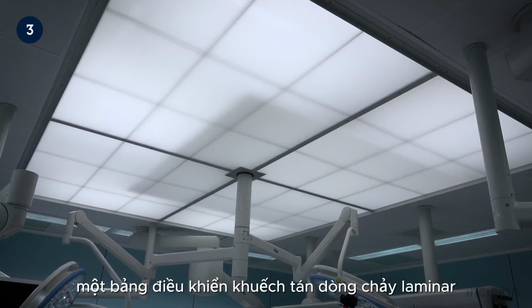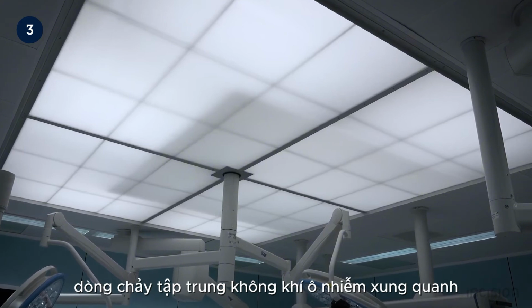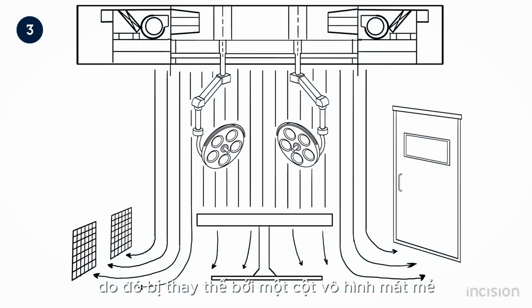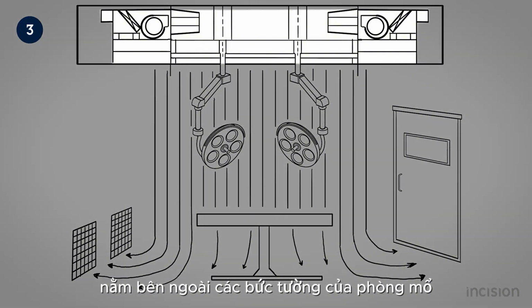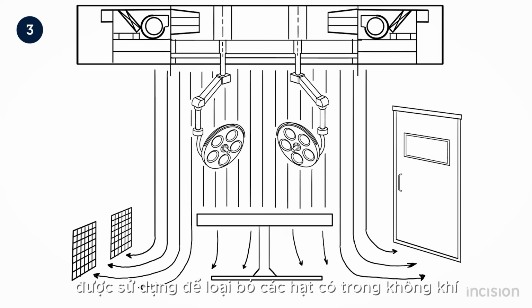A laminar flow diffuser panel concentrates and directs a downward airflow, concentrated downflow. Polluted ambient air is hereby displaced by an invisible column of cool and filtered clean air. At the same time, a series of vents located in the walls of the operating room provide active extraction, whereby the air is directed via the return air zone, located outside the walls of the operating room, into advanced filters above the ceiling. These filters are high-efficiency particulate air filters, HEPA, used to remove the particles present in the air.